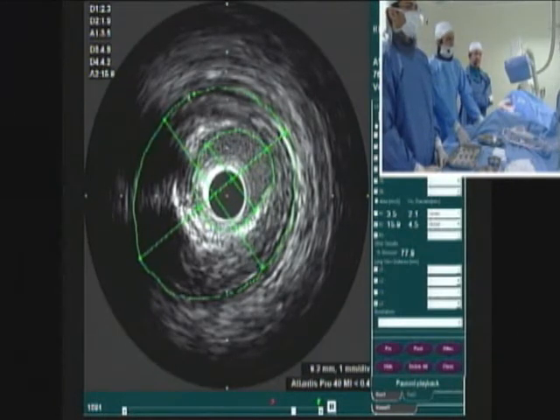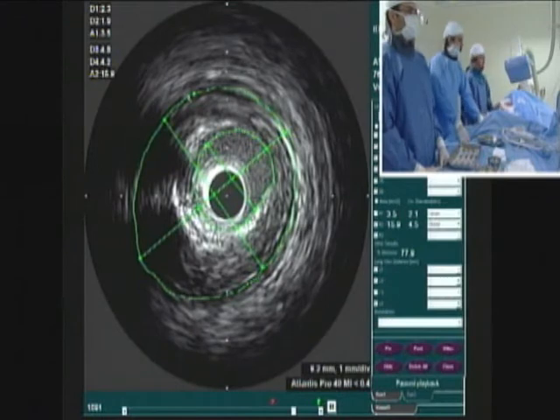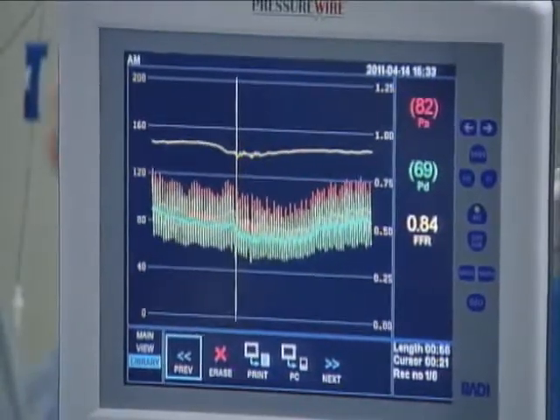3.5 should be fine. Even when you have a long lesion like this? Even if a long lesion. In a vessel which is at 3.0, 3.5. Okay. If it's a vessel 2.5 and less, there is not good correlation. So I guess your study was right, Ron, because that's exactly what we found here. So the vessel, again, the minimum lumen area was 3.5. And if somebody can help us with the FFR, you see the images. For FFR, we got the number which will be shown on the screen. 0.84. 0.84.